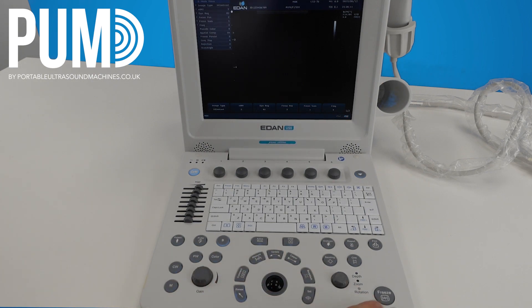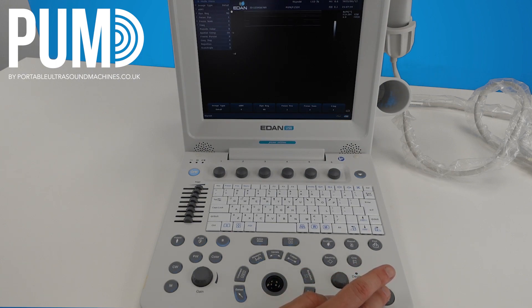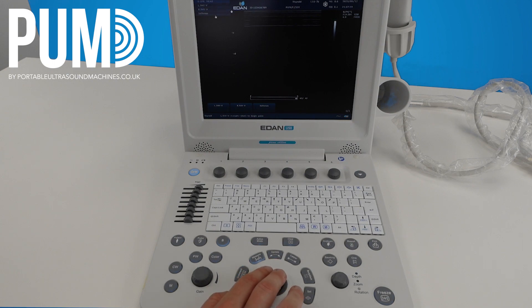For measurements you have two options. Freeze the image, hit caliper, and you can do a generic measurement — adjust the cursor to where you want it, hit set, then measure across and you'll see the result. Alternatively, you can do a labelled measurement: hit freeze, select measure, and you will get labelled measurements. Note that in the MSK preset we don't actually have any labelled measurements, but if for example you change the preset to thyroid, you'll notice there are some labelled measurements available. Select the one you want, do a measurement, and you'll notice it has a label.